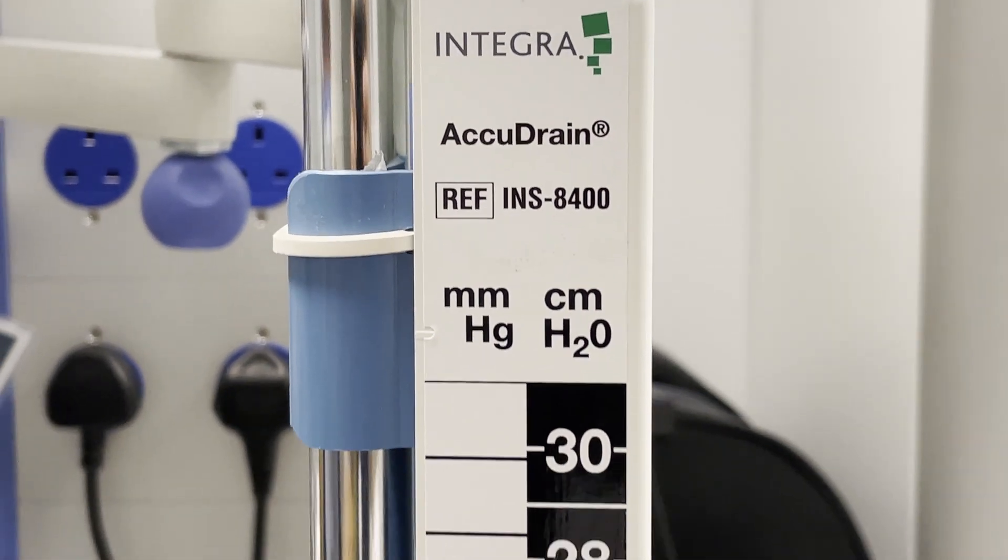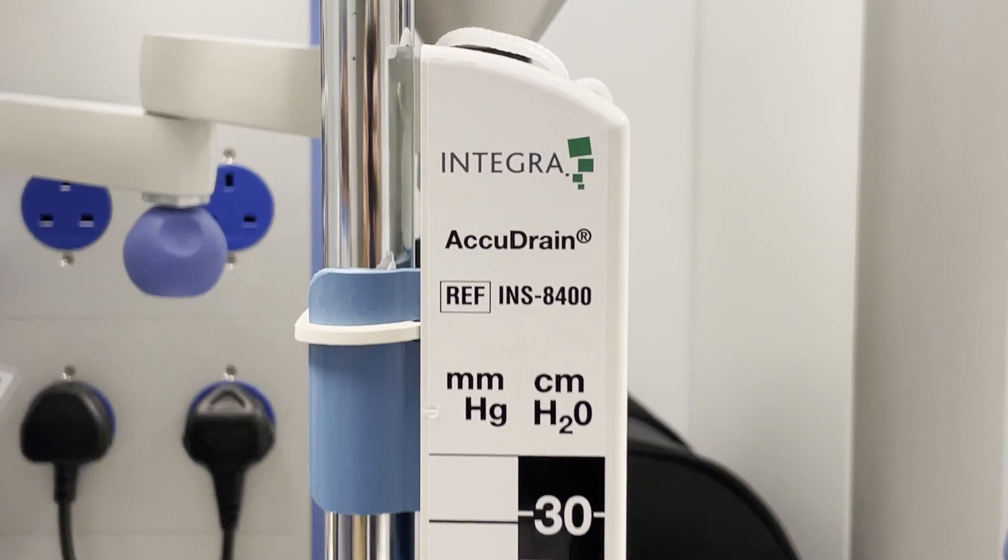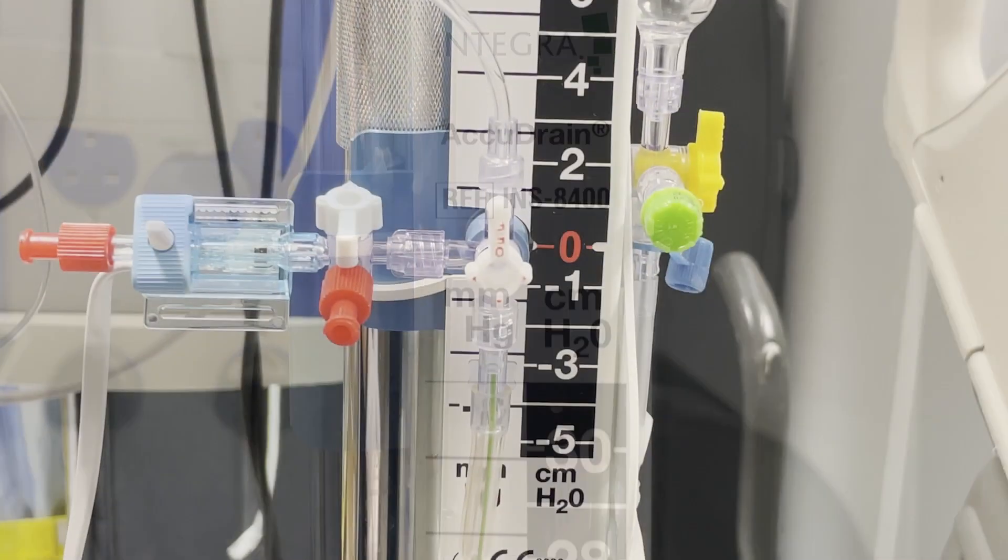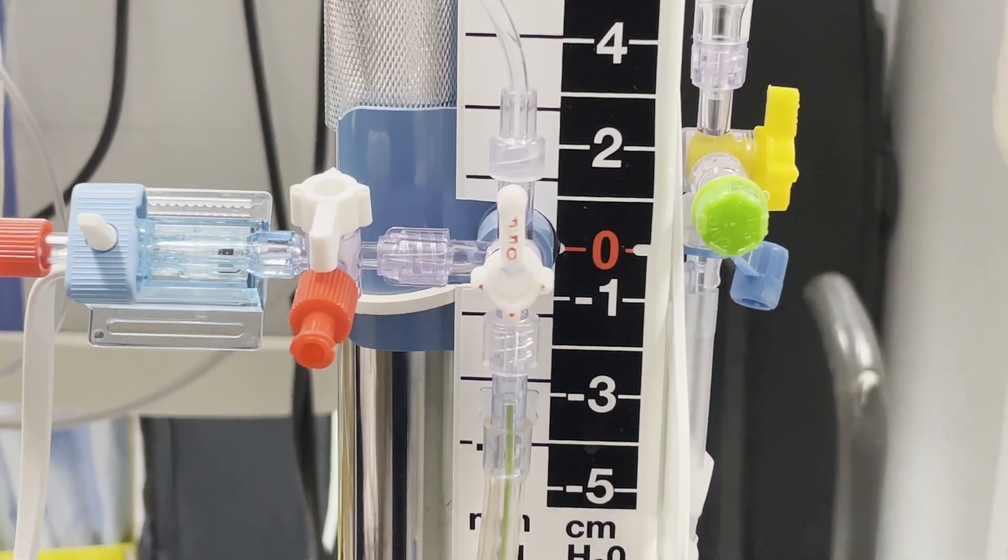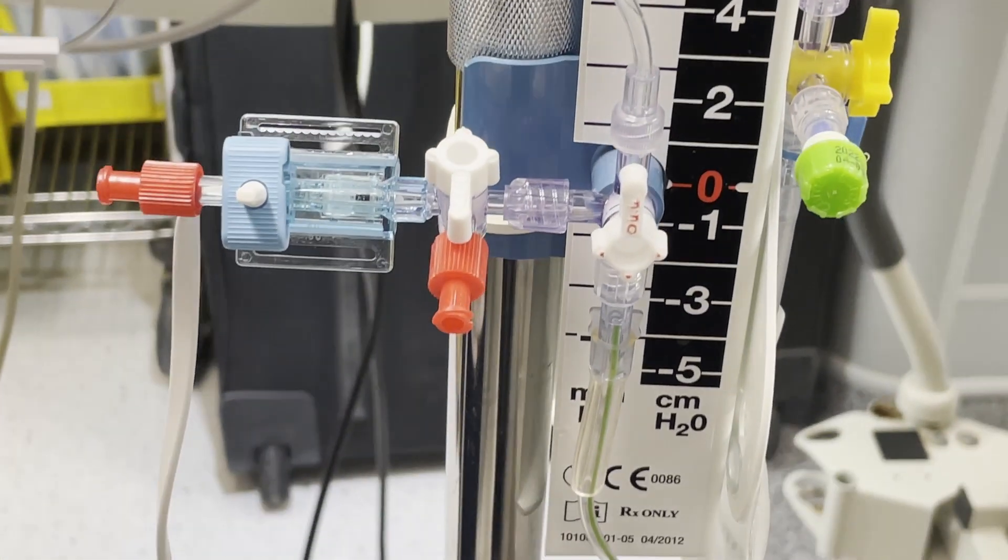In order to get an accurate ICP reading when you are using this type of EVD, they call it Integra, the first thing we have to do is close the relationship between the patient and the atmosphere, the air vent.